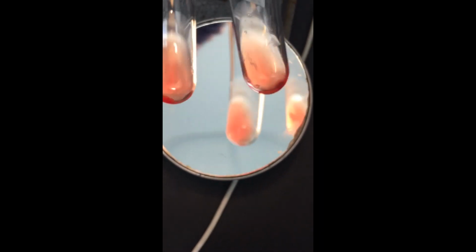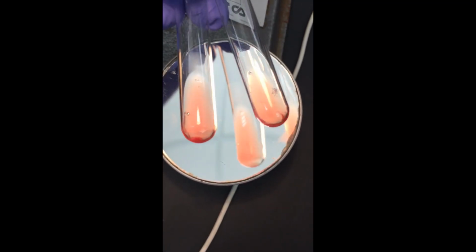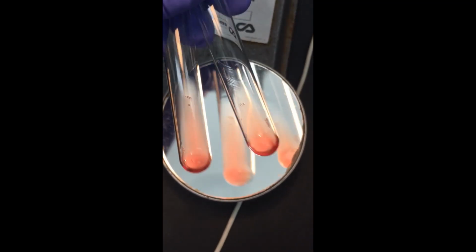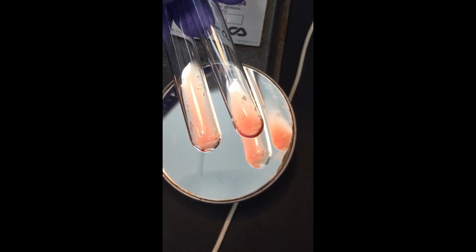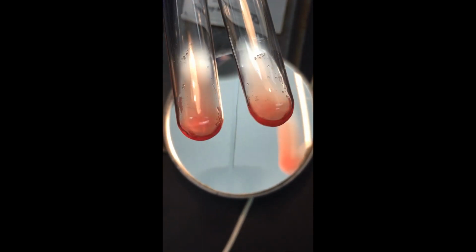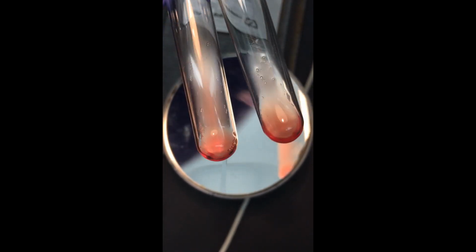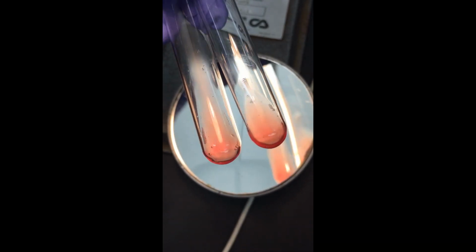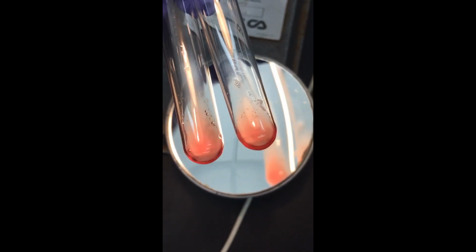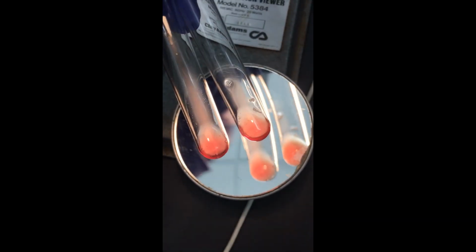Okay, so now we've added our low ionic strength saline, LISS, to our tubes and done an immediate spin. On your worksheet, it is RT albumin. That's where you need to put these results. See if I can get them nice and close for you. So this is tube 1 on the left and tube 2 is on the right. Regardless of the results that you get at this point, I want you to keep working through. Okay, 1 and 2.